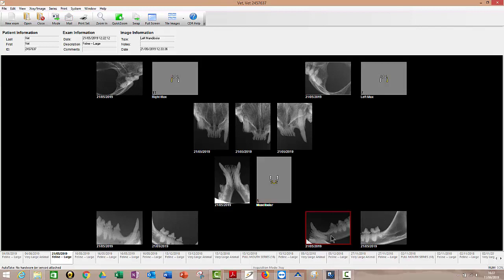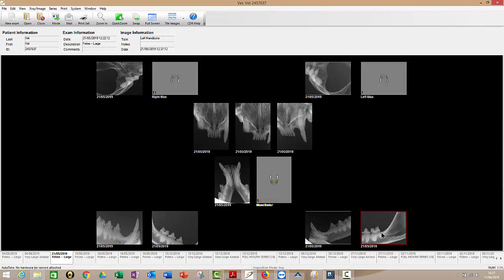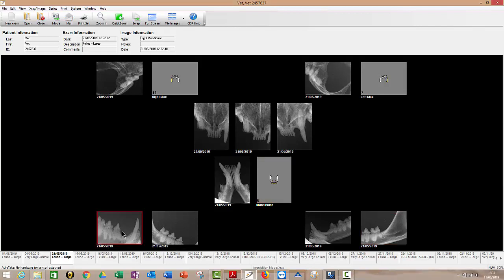Doesn't matter if the tongue is between the sensor and the tooth, by the way, that's fine. So you take this image and then you just literally move your x-ray source around so that it's pointing at the premolar to take these two views here. And then you either move the sensor further back in the mouth to get these views here. Or you would take the sensor out, place it horizontally in the cat's mouth and fire straight on at it. So this one is at a bisecting angle and this one is just firing straight on at the sensor.